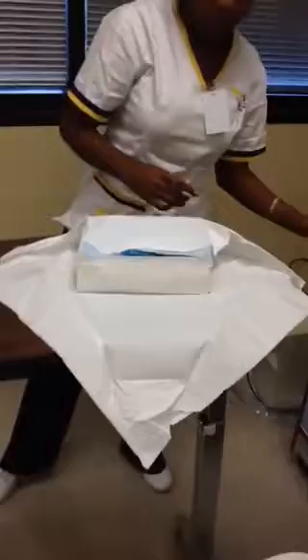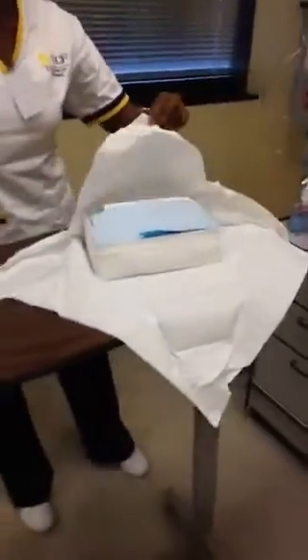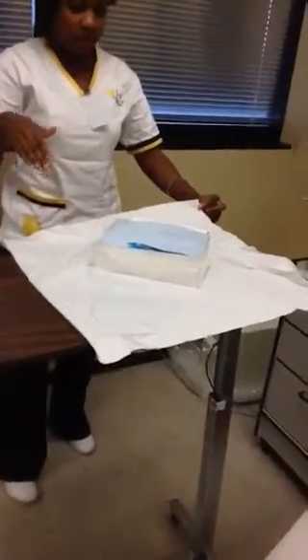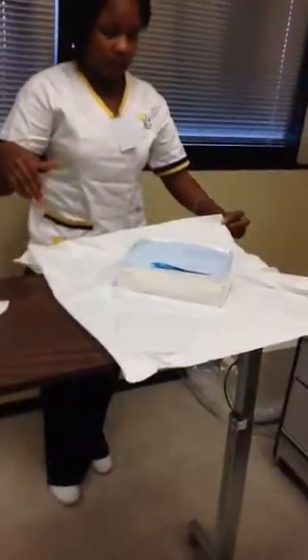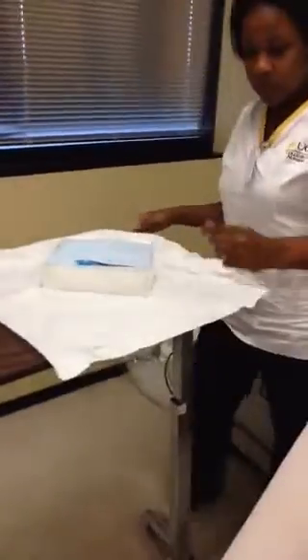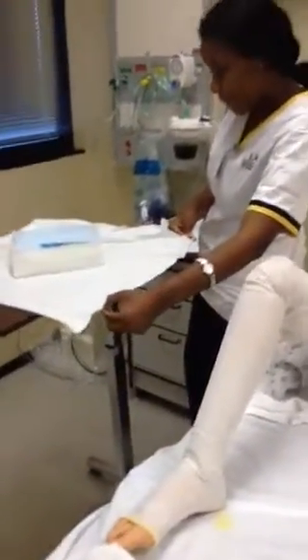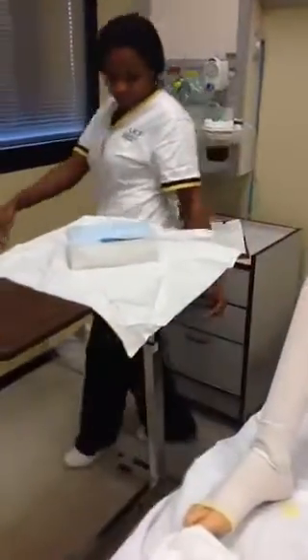I can put this one away and close. Now I'm going to fix my sterile technique. I have too much hanging on this side, so I'm going on this side because I don't want to touch it. Okay.